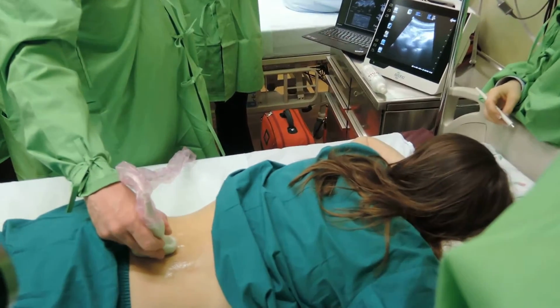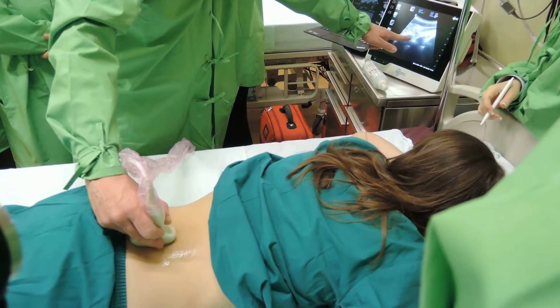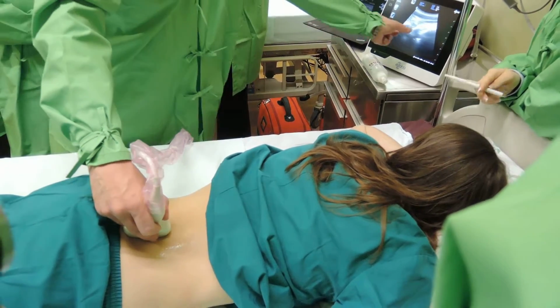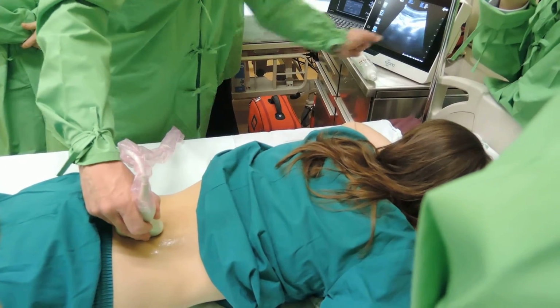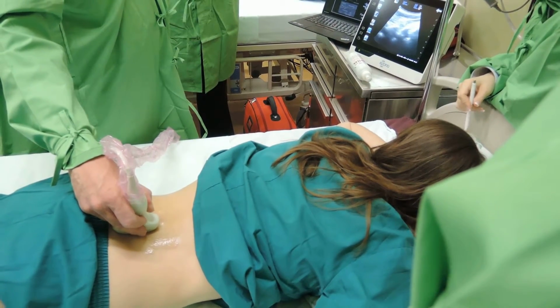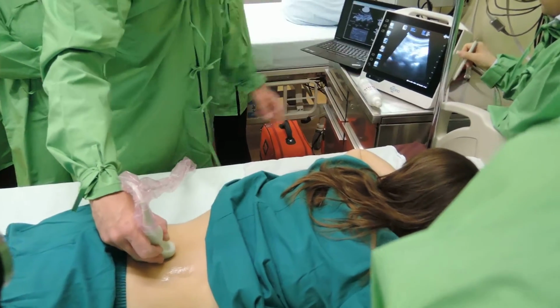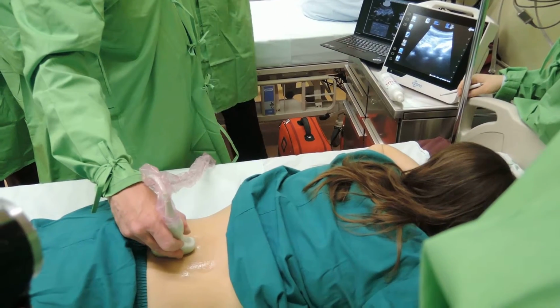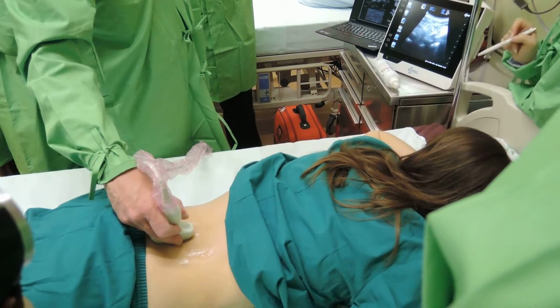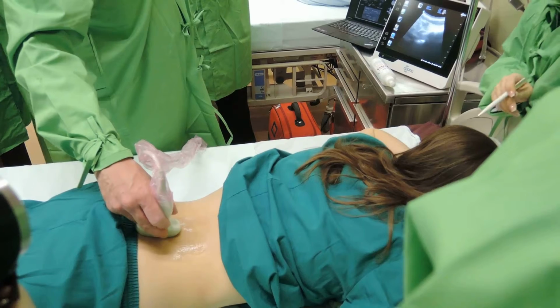What is typical is that the height of the fifth vertebra is a little bit smaller than that of the fourth and third and so on. In addition, the height of the fifth vertebra will be smaller than all the previous ones. What can be seen here is that it is smaller than the fourth lumbar vertebra. The fifth is lower in height. Okay. Yeah, but you are showing this one, you say this one is smaller than this one. That's my question. And the other, yeah.